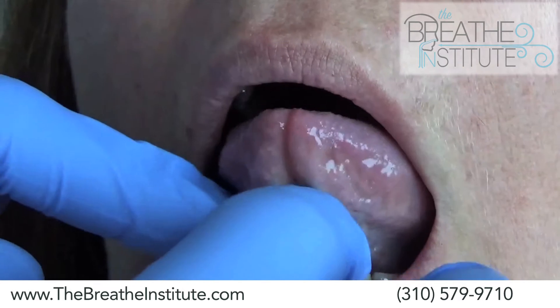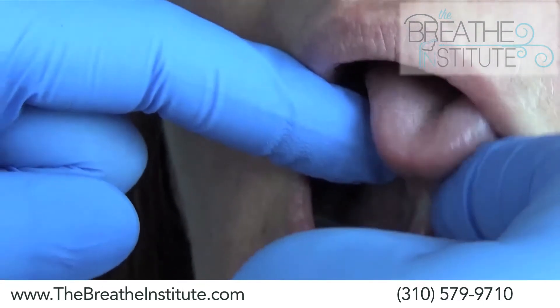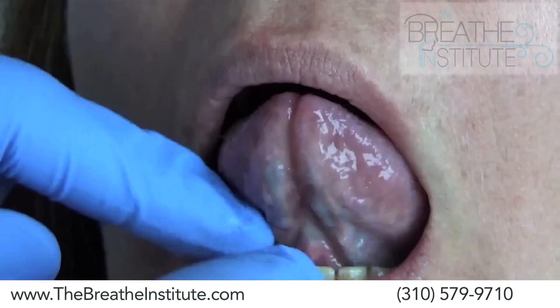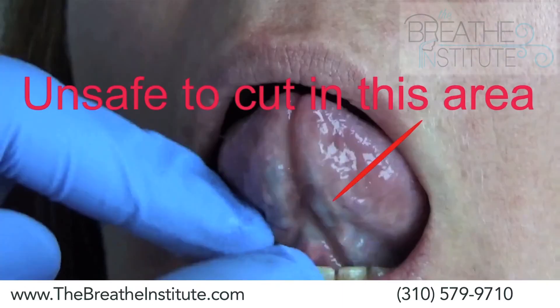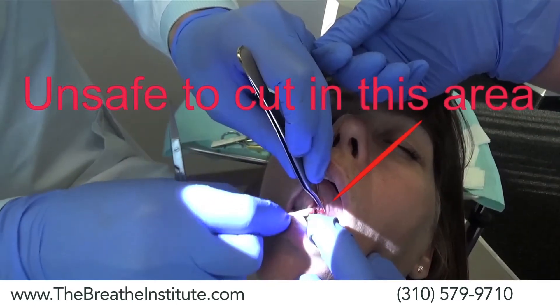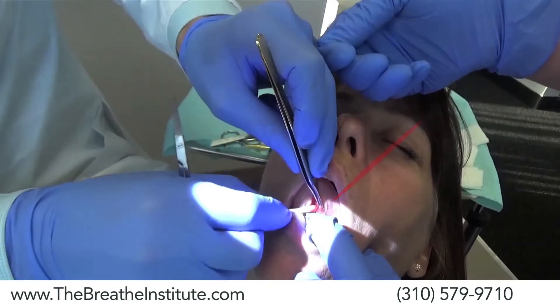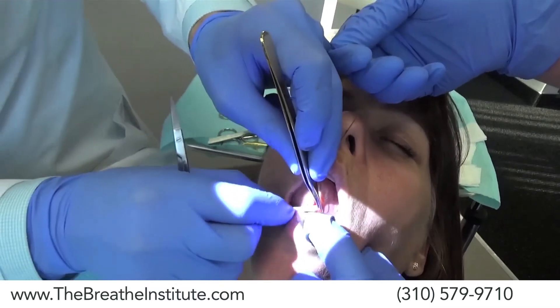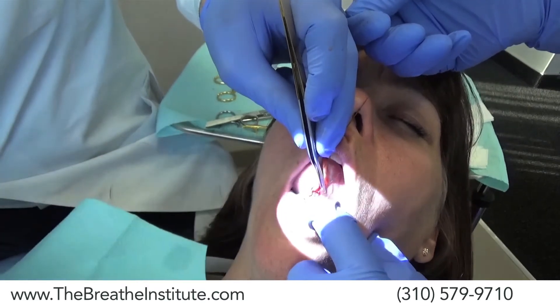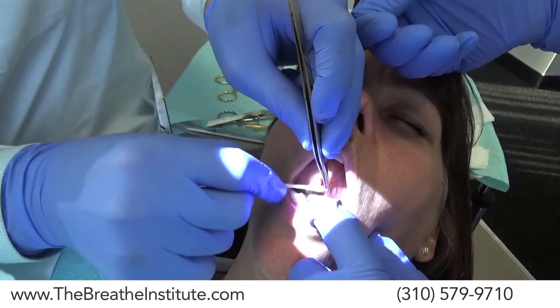You can see how the floor of mouth is elevating here — this is a compensation. There shouldn't be so much strain right here, so the target of surgery would be deep in here. Part of the reason why the lingual frenectomy failed before was because of these large blue blood veins that you can see on either side of the tongue. Dr. Zaghi has developed specialized procedures that allow him to go deeper into the tongue and further to the side without damaging those blood vessels, so that he can get a deeper, wider release.